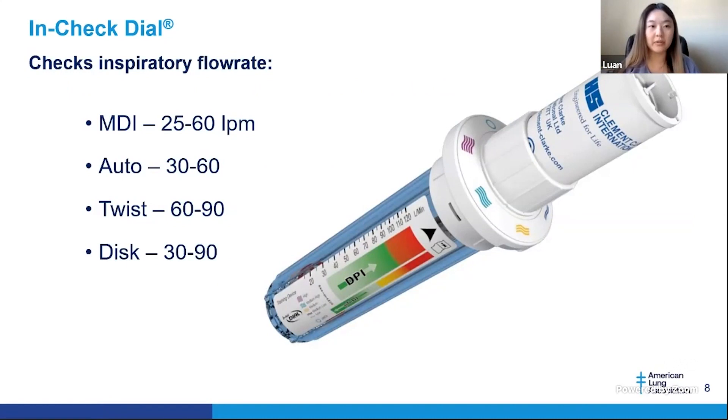Today, I'll be going over the inspiratory flow device, also known as the InCheck dial. This is a handheld respiratory flow measurement device with a dial top. It is portable, and the dial can be adjusted to simulate the resistance of popular inhalers available in the market. The InCheck dial enables clinicians to train patients to their proper inspiratory technique considering the force and the flow rate to achieve optimal deposition of the medications into the lung.